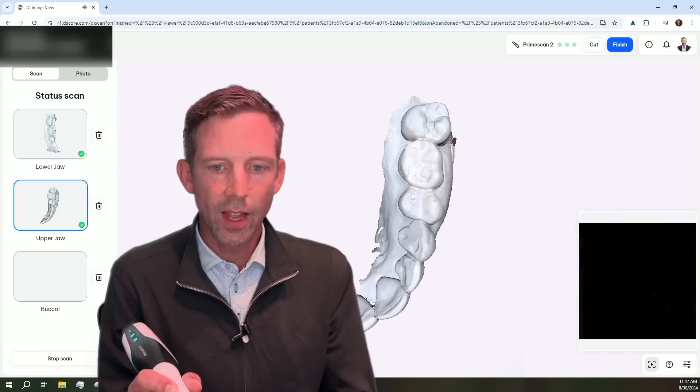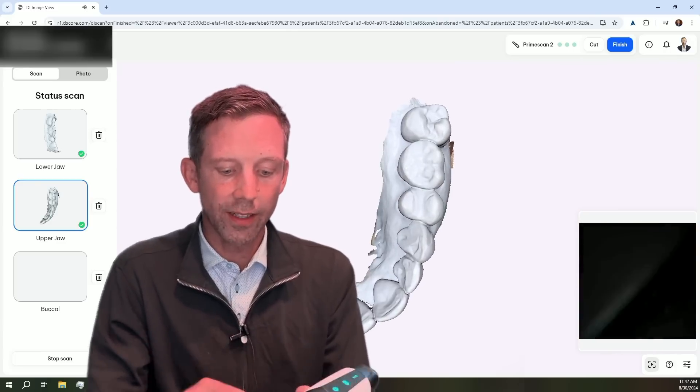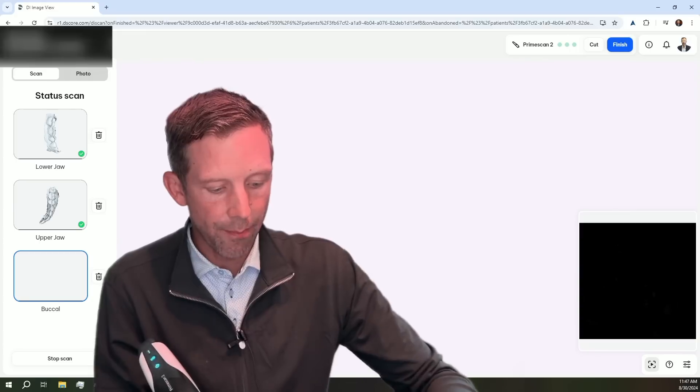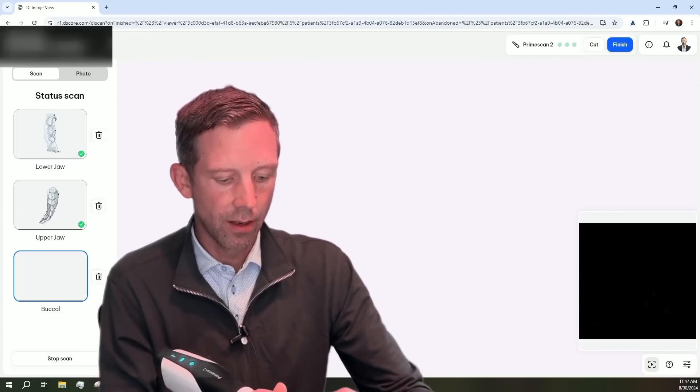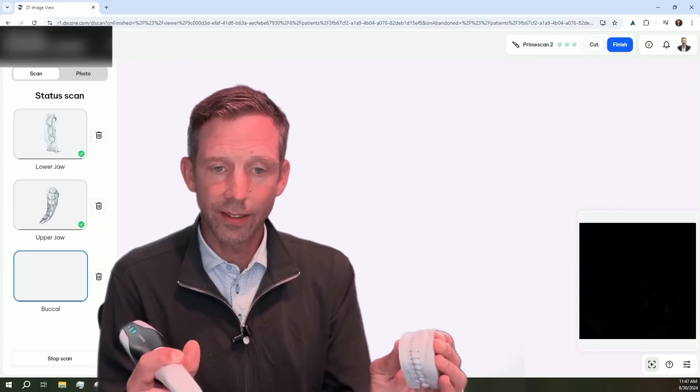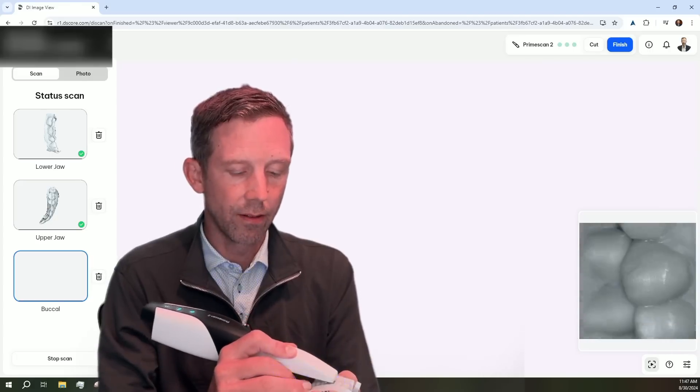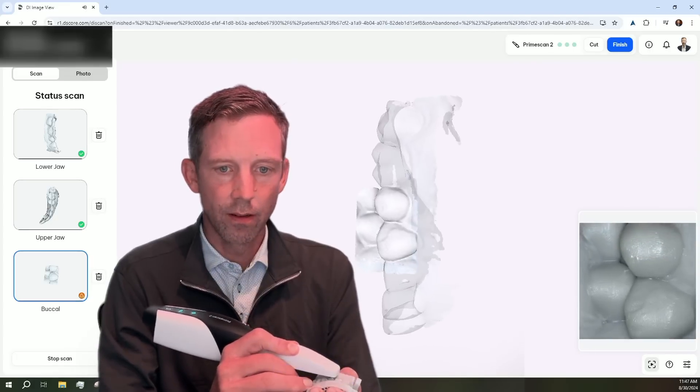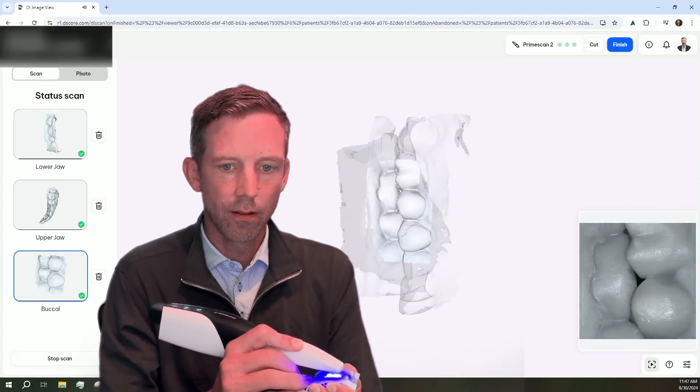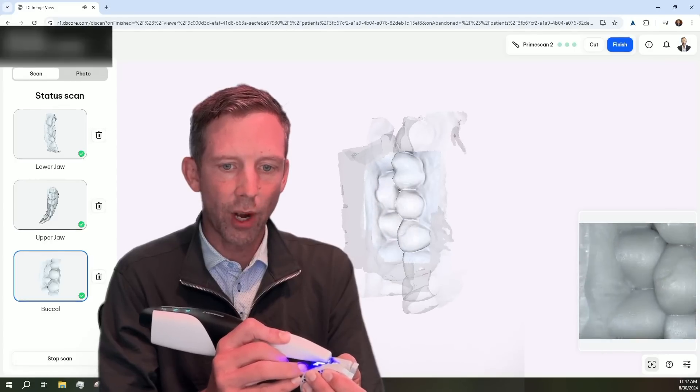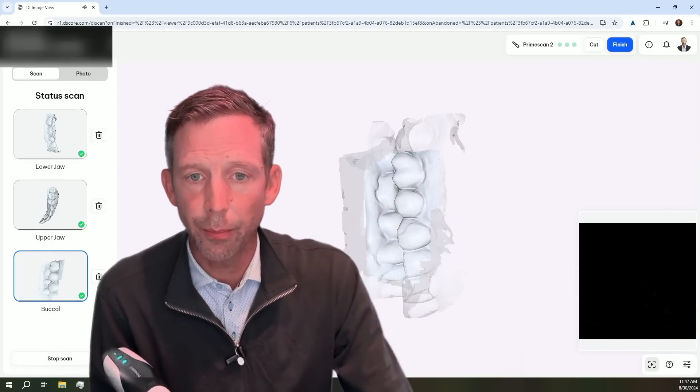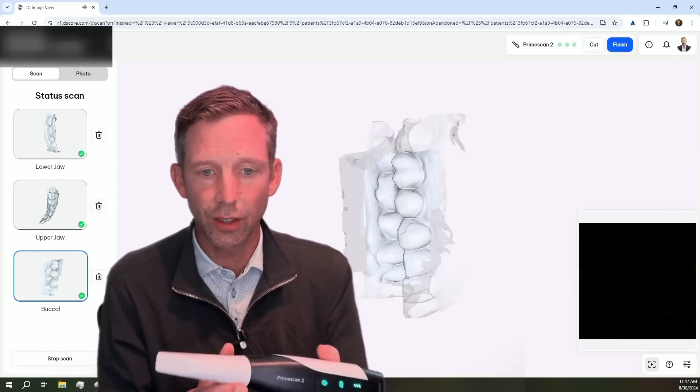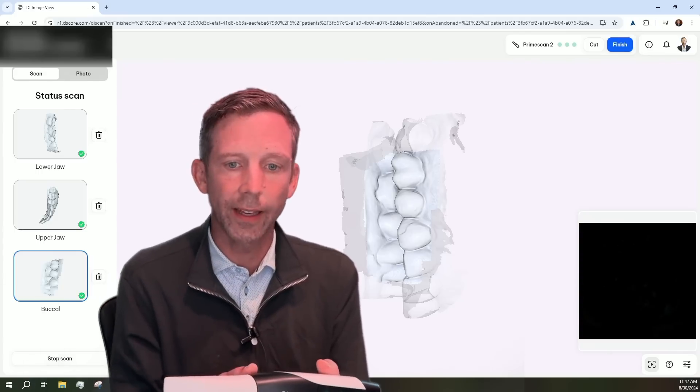And now we'll go ahead and double click this. And that's going to change to my buccal bite. And we'll go ahead and scan the buccal bite. And obviously, the PrimeScan 2 is going to behave just like the PrimeScan 1, as we have the ability to go ahead and take double buccal bites if we would like.